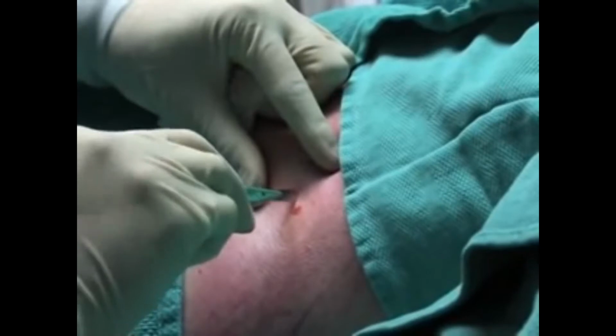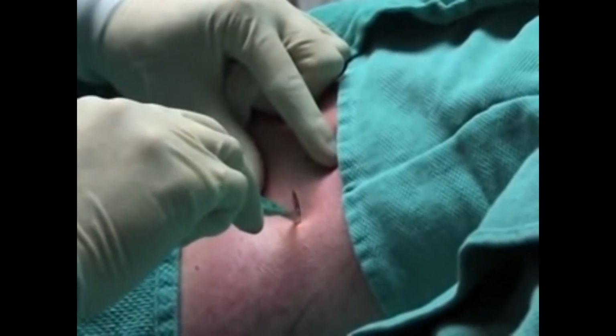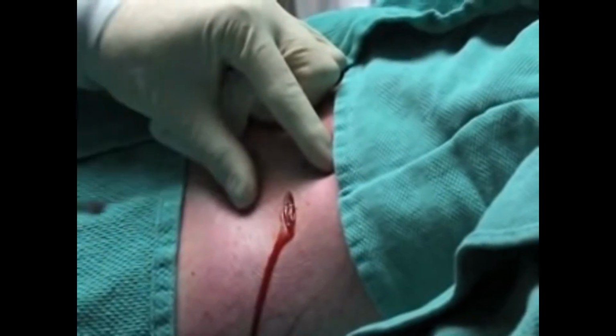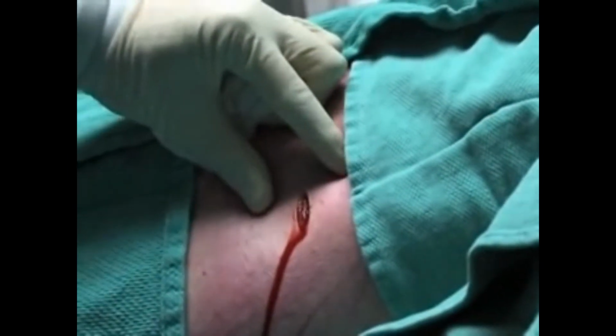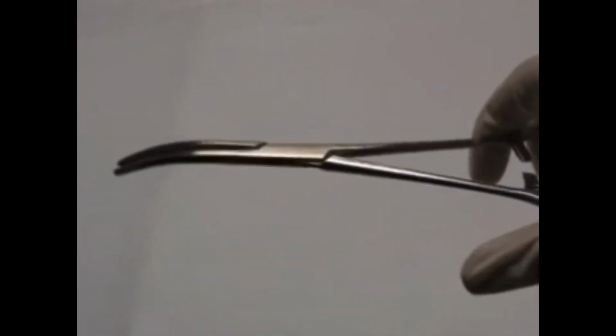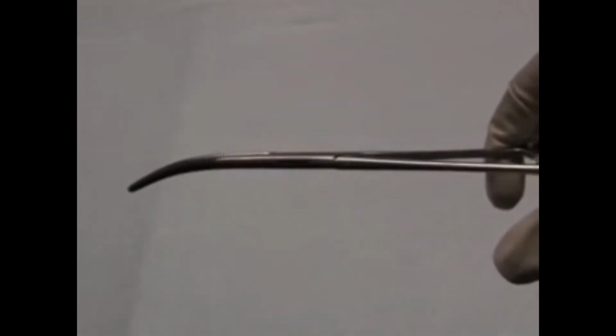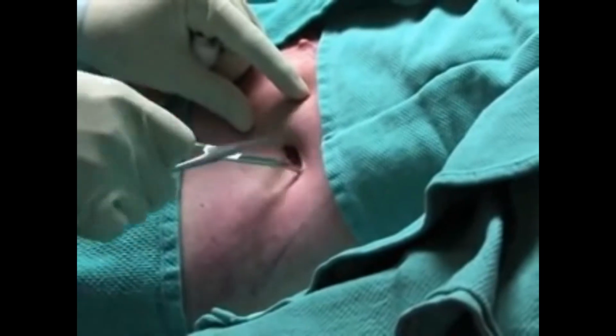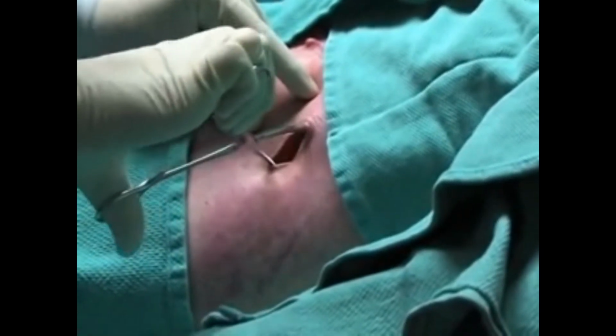Conduct a timeout to verify the patient's identity, correct site, and correct procedure. Make an incision approximately 1.5 to 2 cm in length above and parallel to the anesthetized rib. Introduce the Kelly clamp into the incision and begin to dissect the subcutaneous tissue in order to reach the intercostal muscles.